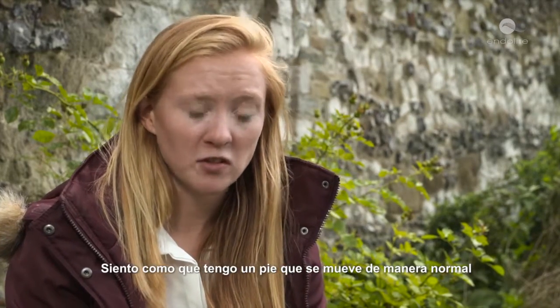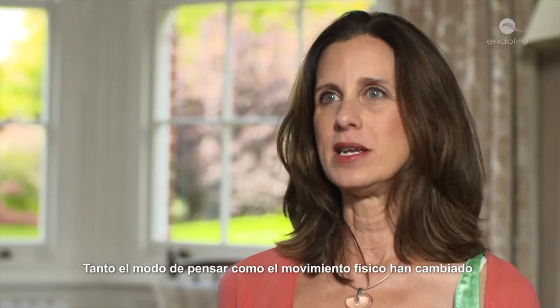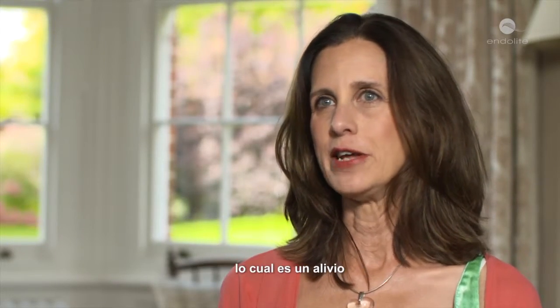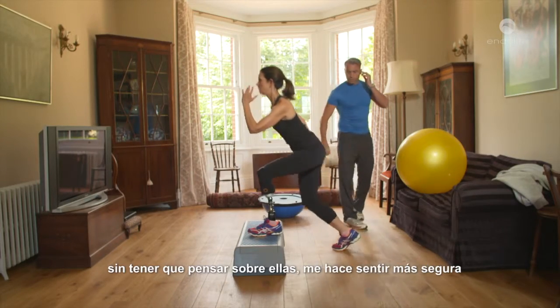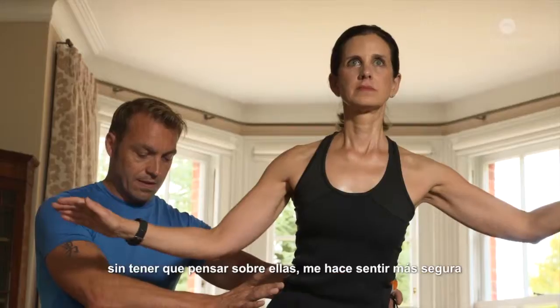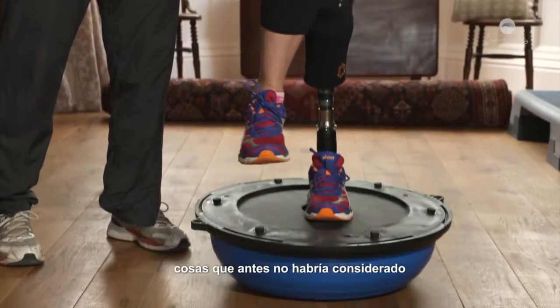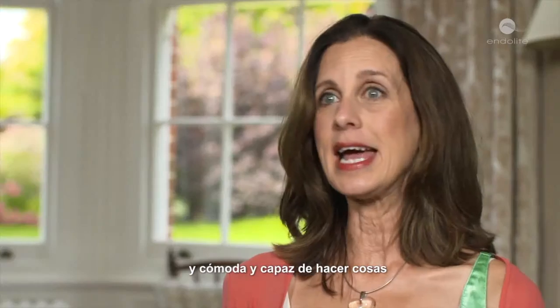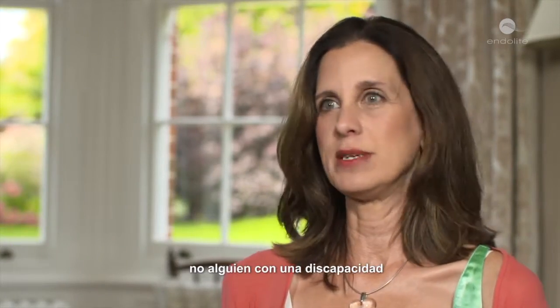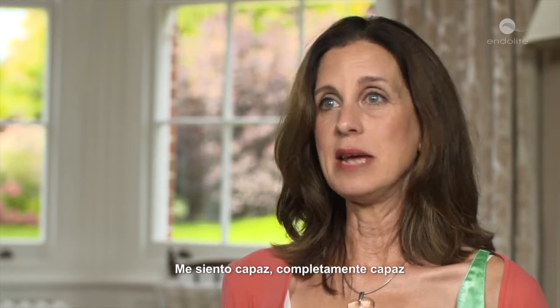I feel like I've got a foot with normal movement. The mindset has changed as well as the physical movement, which is a great relief. Knowing that I can do these things more easily without having to think about them makes me more confident — makes me try new things I wouldn't have tried before. It just makes you feel good about yourself, confident and able to do things — not somebody with a disability. I don't feel like somebody who has a disability. I feel able, fully able.